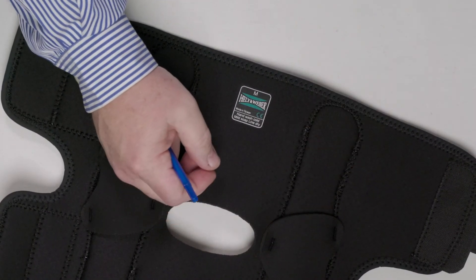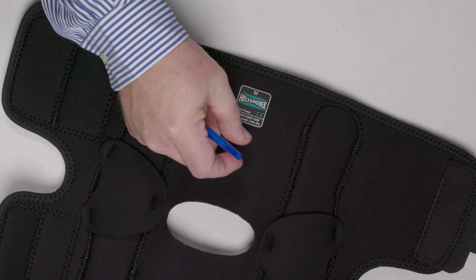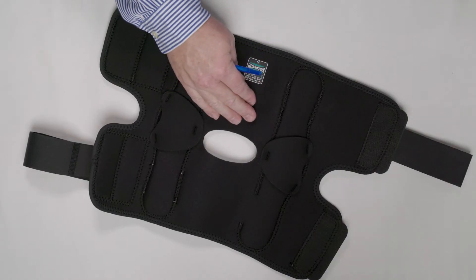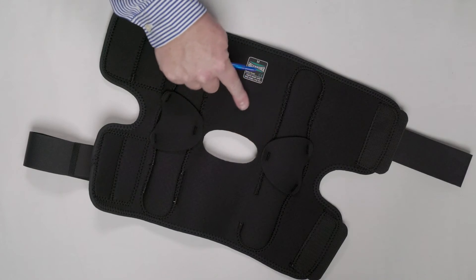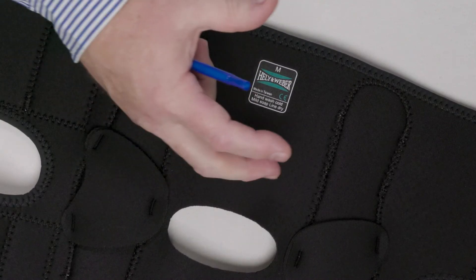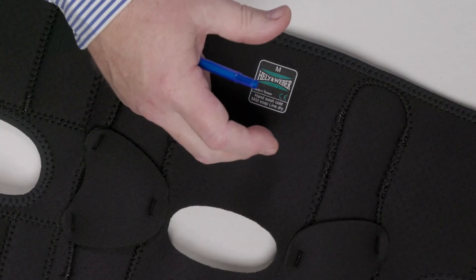"Cool" means it's perforated, and that allows breathability. About 80% of the water vapor is dispersed through these perforations in the brace, so you get compression and warmth from the neoprene without all the sweat.